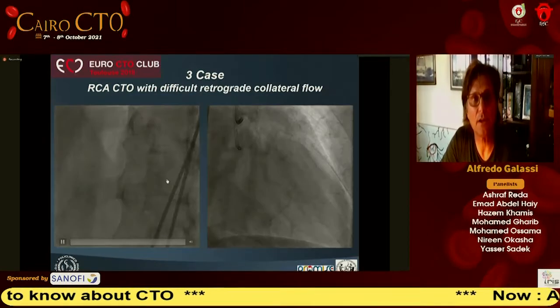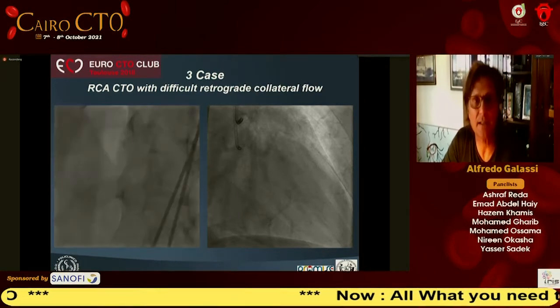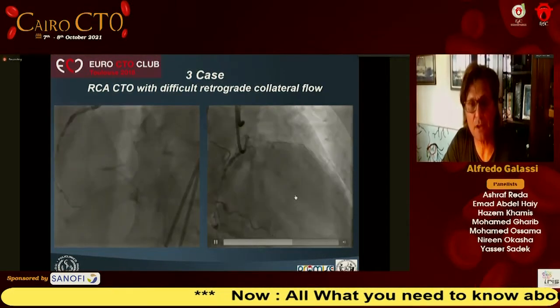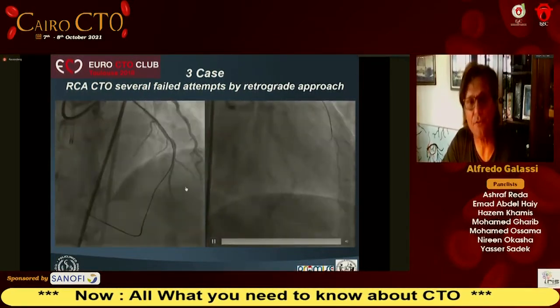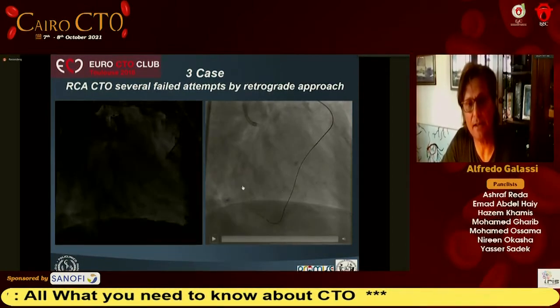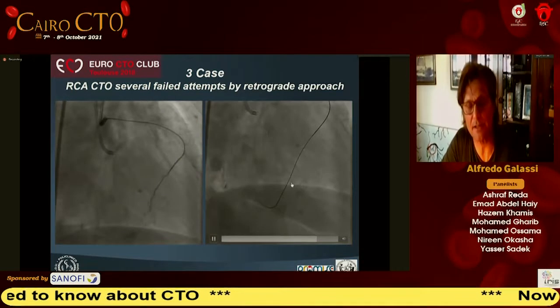And now I would like to show you what we call the first stenting, if I have some more minutes. This is a case that I did live in Toulouse, 2018. Very difficult, cumbersome collateral circulation. We tried our best. It was a very long procedure. It was a live case, so everybody was waiting for the retrograde option. I was really having a hard time, but unfortunately, because of this small vessel and collaterals, I was always going into some marginal branch, never the right one.